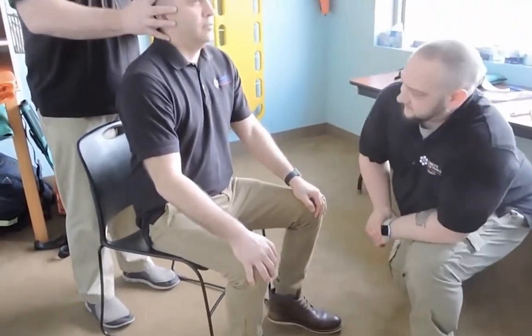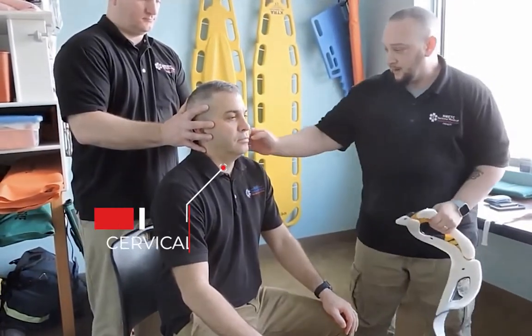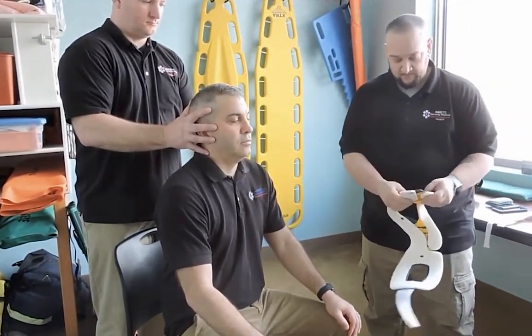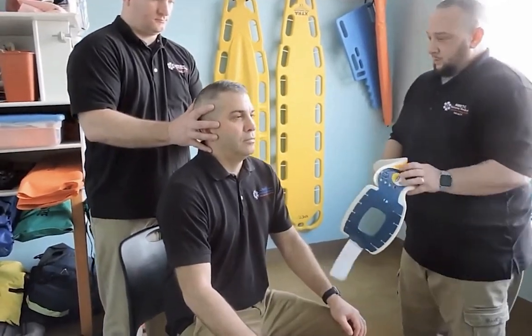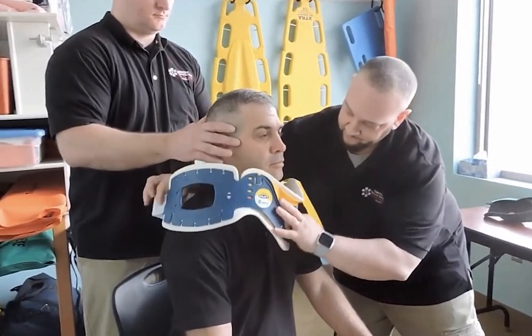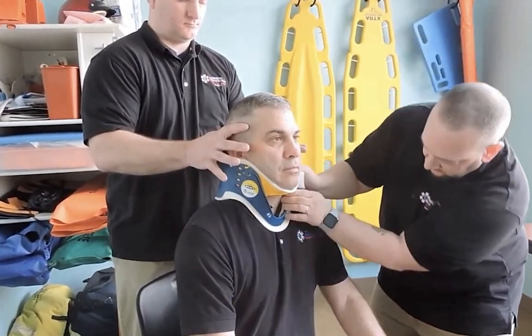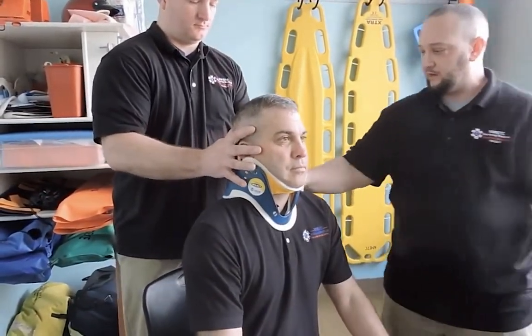So we have C-spine taken by my partner. We're now going to size and apply a cervical collar. I'm going to measure from the trapezius to the angle of the jaw using my hand, then measure against my collar, making sure it is properly sized and locked into place. We're now going to come in and work around my partner and apply this — this would be on bare skin. I'm going to scoop this around the neck, making sure it's tight. We can see through the window, and it's in place.